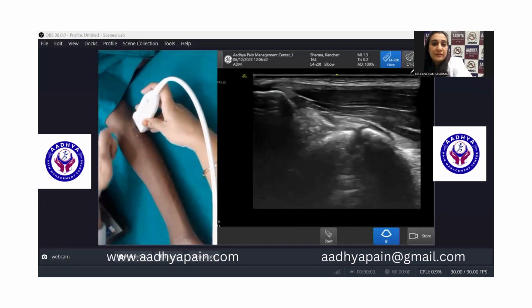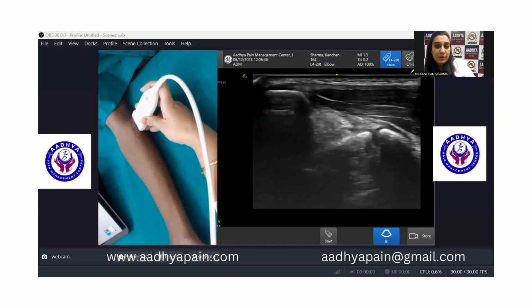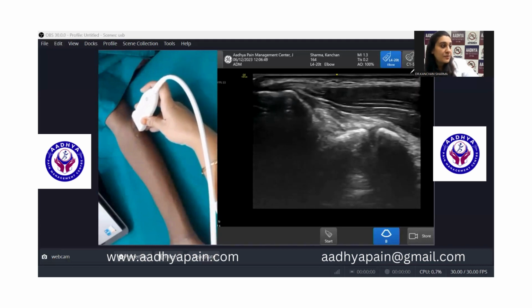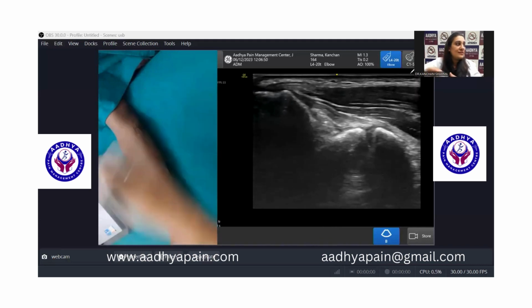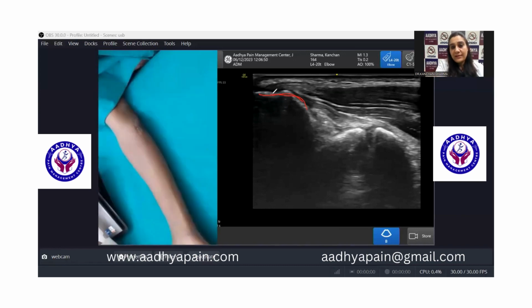So now you know that the thing you are seeing is the medial epicondyle. So I'll just freeze it here. We will quickly see the structures, and then I'll show you what exactly should be the end position of your probe. What you are seeing here is the medial epicondyle. That is the downward slope of the medial epicondyle, which later on becomes the trochlea. This is the trochleo-ulnar joint, and that is the sublime tubercle.